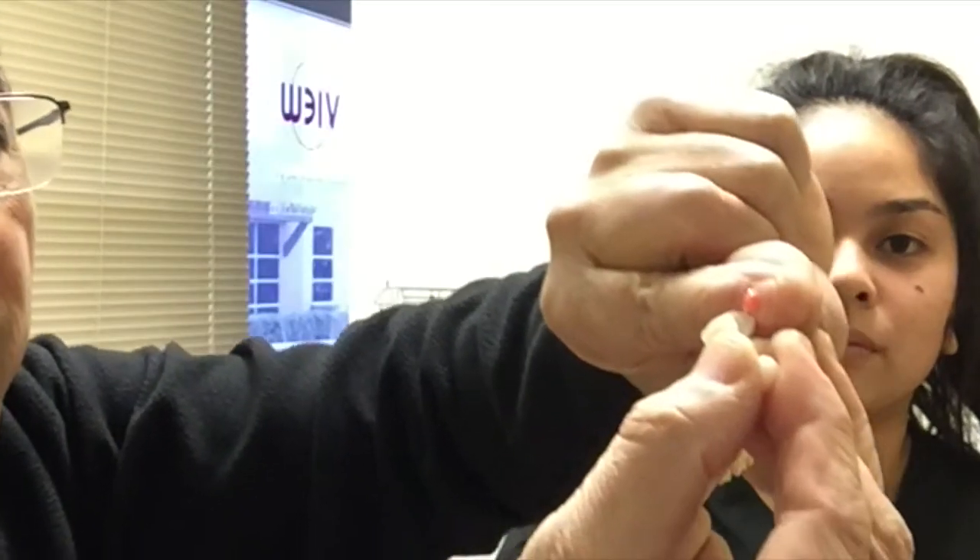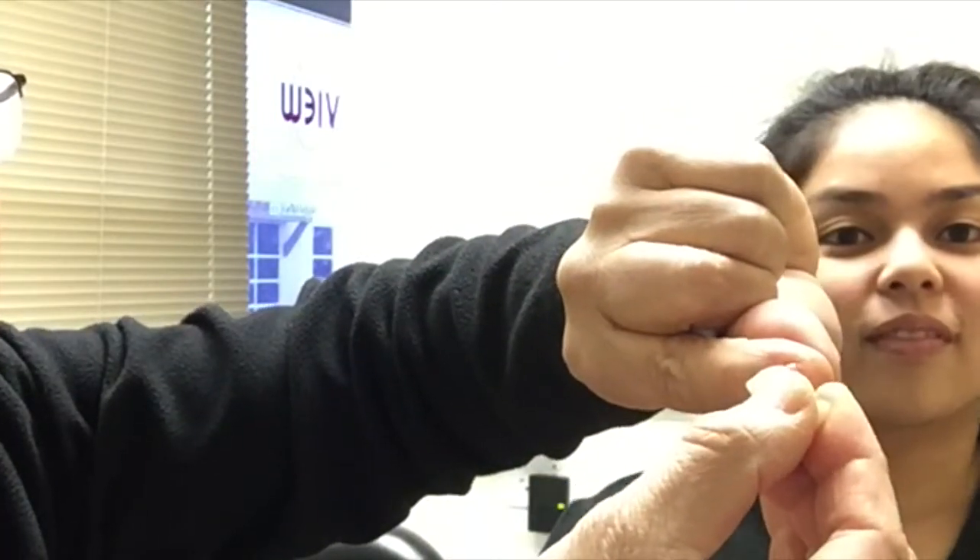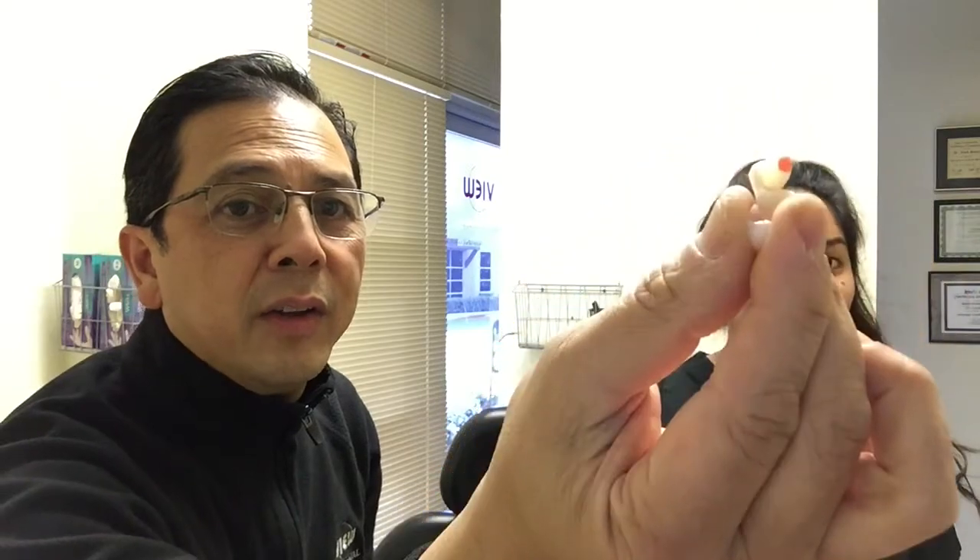There's a paste. And if you have that denture paste, you could put it over here a little bit. So now you've got a denture paste on the tooth. Then once you put that in there, you put it right back.